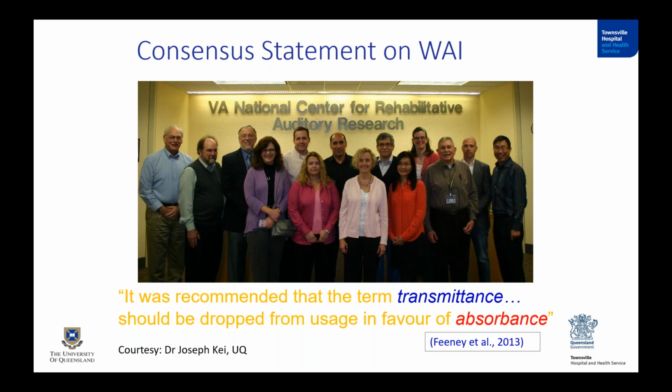And also earlier, with the absorbance measurements, I said even the admittance can be measured. The admittance can be expressed either in terms of millimhos or in terms of decibels. And if it's measured in terms of decibels, it's also called transmittance. So they said we should not use the word transmittance, and only the term absorbance should be used. So after 2013, if you see any of the studies, they're all in terms of absorbance rather than reflectance.